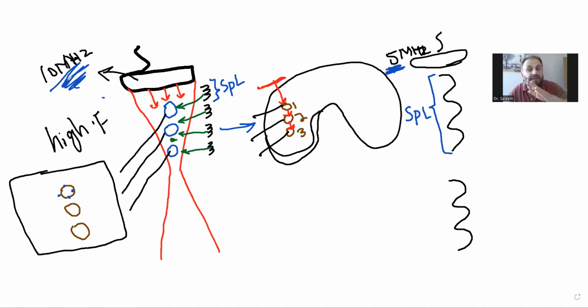High frequency cannot penetrate better. Then that's the only option: you have to use the low frequency. For example, if you're looking for the pancreas, the kidney, or the quadrate lobe of the liver, then your high frequency transducer cannot image correctly from that area because it will attenuate fast. So that is a different story in that case.